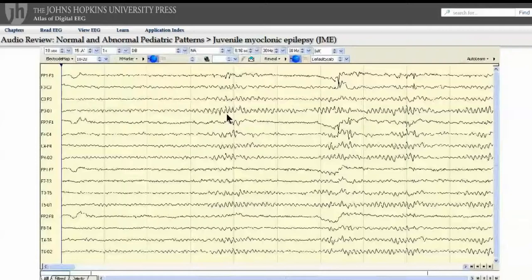This EEG also shows a bipolar montage. In this case, this is an adolescent who is awake. Next to the black arrow, you can see the posterior basic waking rhythm. In counting it out, it is at about 11 Hertz. This alpha rhythm is within normal range.